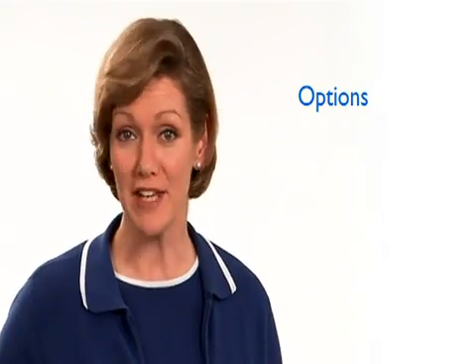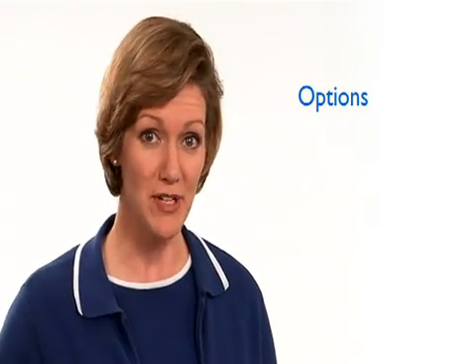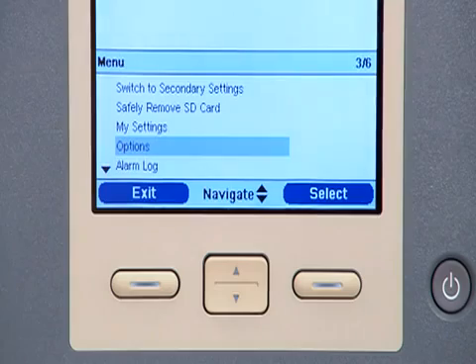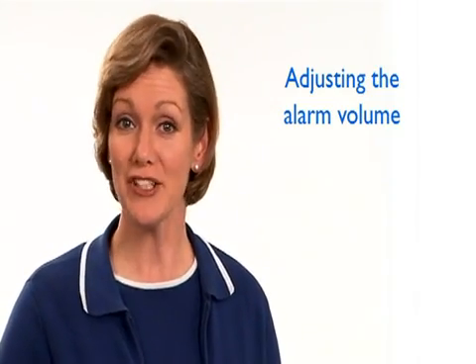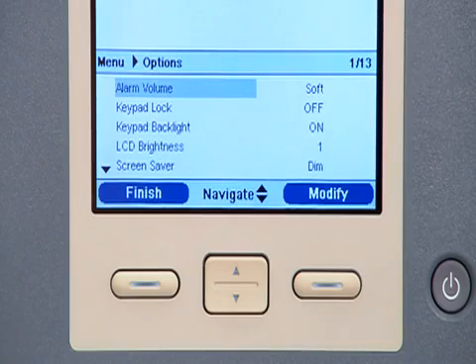There are a variety of options you can set with Trilogy100. To look at the options, from the menu screen, use the Up-Down button to highlight Options, and the right button to select. In the Options menu, you can view and change the alarm volume and keypad lock. To adjust the audible alarm, move the Up-Down button to highlight Alarm Volume.